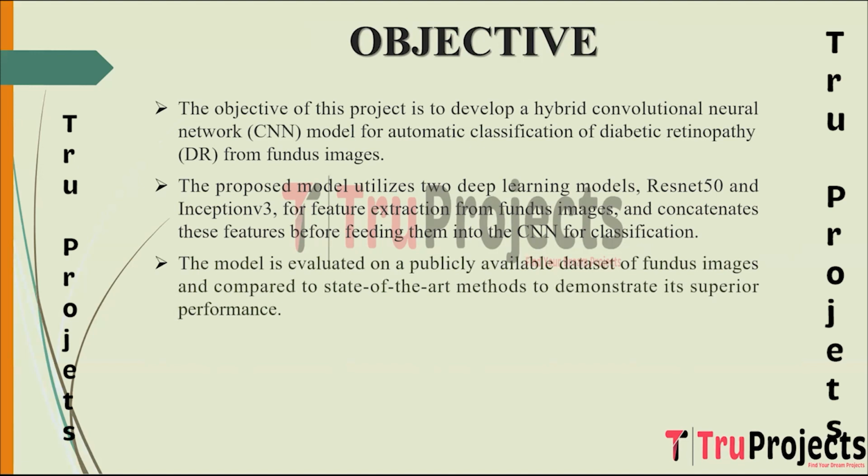The model's effectiveness and accuracy are thoroughly assessed using a well-established dataset of fundus images. It undergoes rigorous testing and comparison against existing state-of-the-art methods in the field of diabetic retinopathy detection. Through this evaluation, the model's superiority and enhanced performance over other techniques become evident.